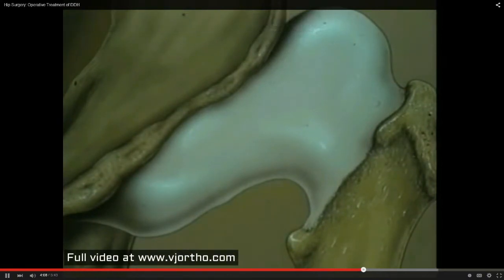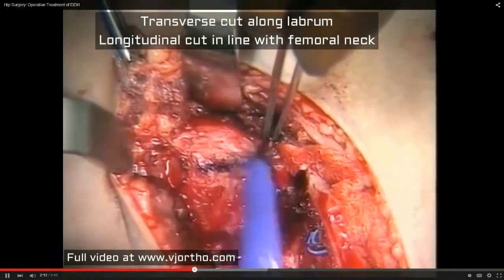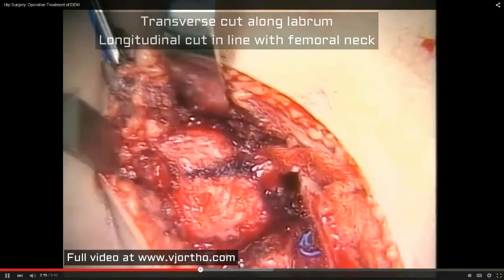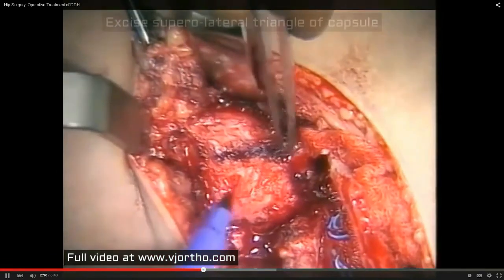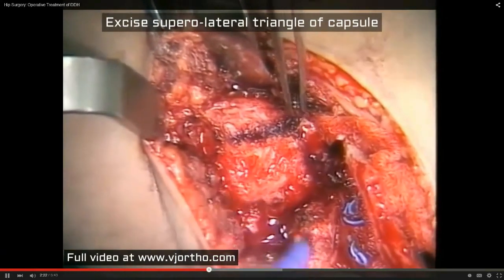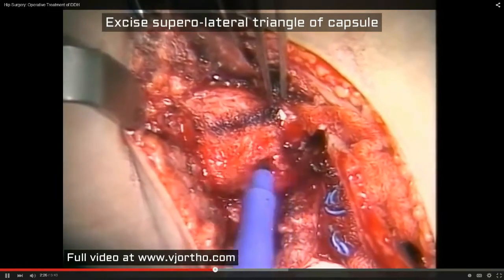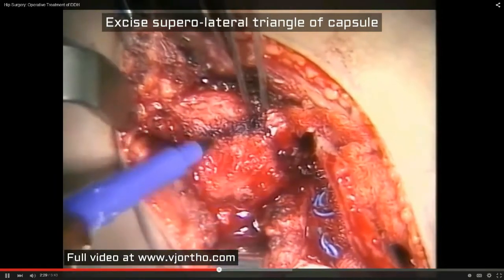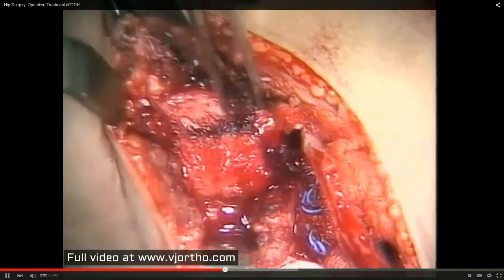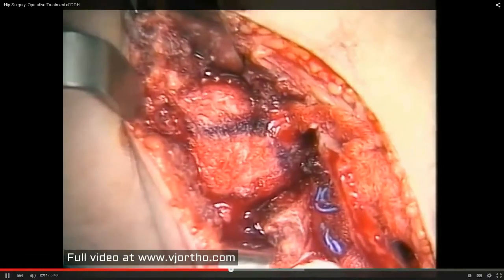We're going to make a transverse cut along the labrum, and then a longitudinal cut in alignment with the femoral neck. This will develop our flaps, which we'll be describing. The flap that we're going to excise is the superolateral triangle in this schemata. The superolateral triangle will be excised and discarded, and that will allow an internal rotation type of capsulorrhaphy without overlap.